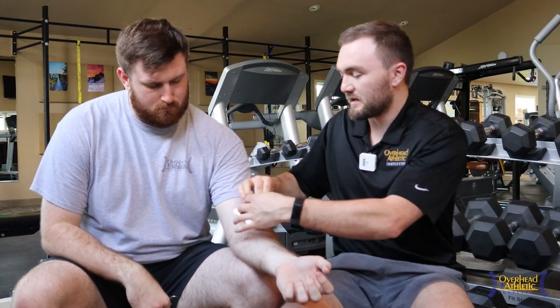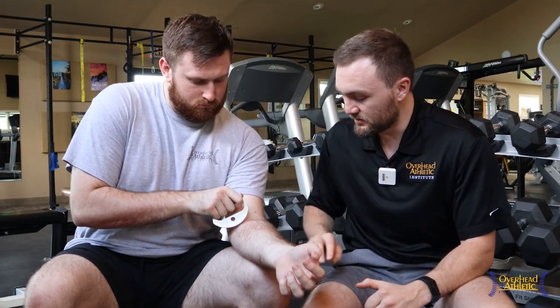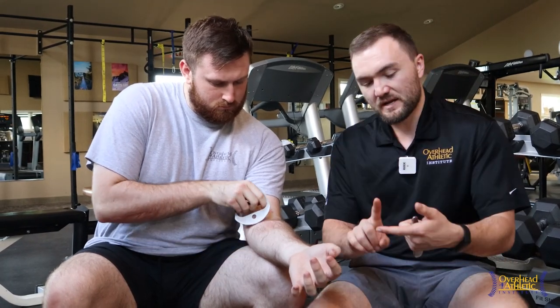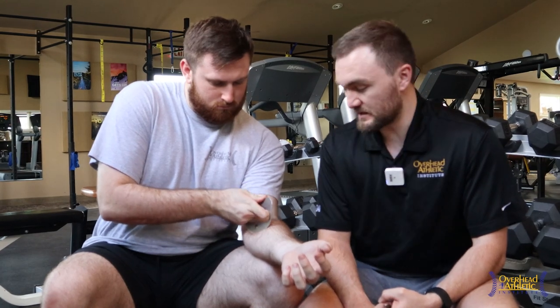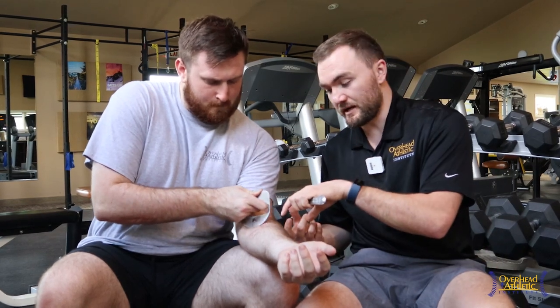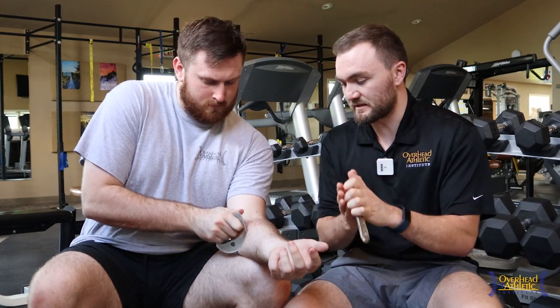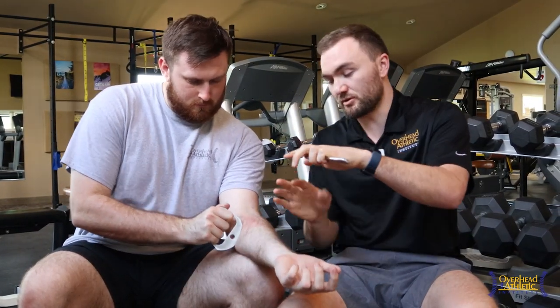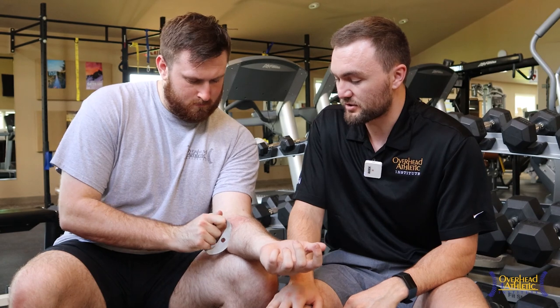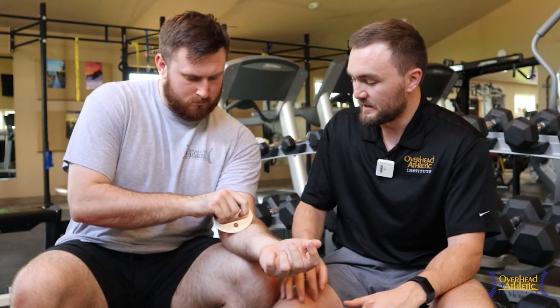Bigger strokes or smaller strokes — give that one a try there, Chuck. You can do this anywhere really in the body — on the leg, on the thigh. The idea is that I'm not going to be pushing so hard that I cause serious discomfort; it might not be the most comfortable thing in the world. But I'm increasing blood into the area — number one, first and foremost, blood into the area. Number two, I'm improving some sliding surfaces, increasing the ability of the superficial layers on the outside to move on the layers underneath. And I can desensitize some painful structures by doing a little bit of this scraping massage. I don't want to cause bruising — a little redness is okay.